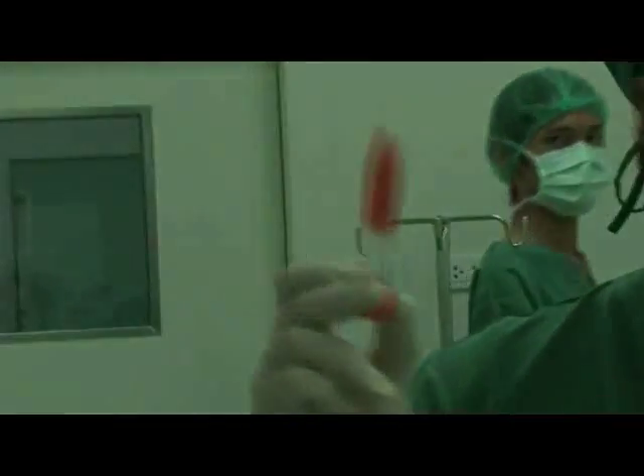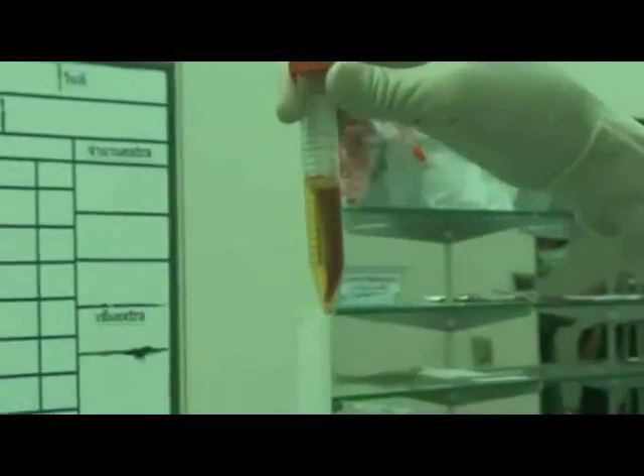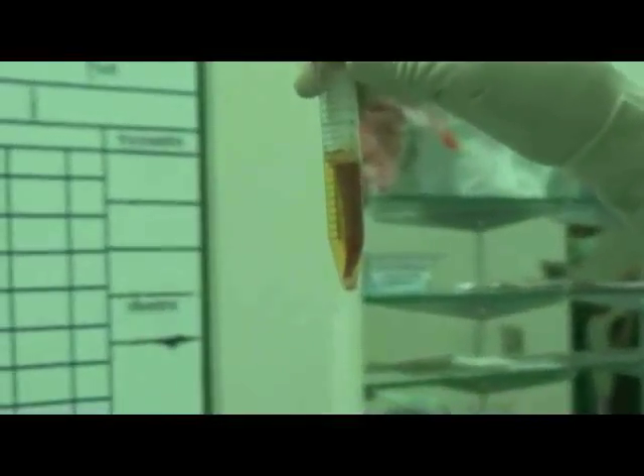Allow the liquid to clot. When the PRP liquid has dissolved from the clot, draw out 3 milliliter of the liquid and discard the clot.